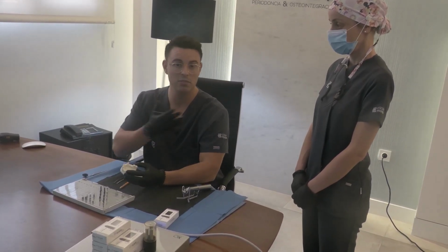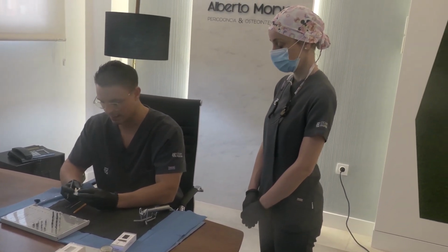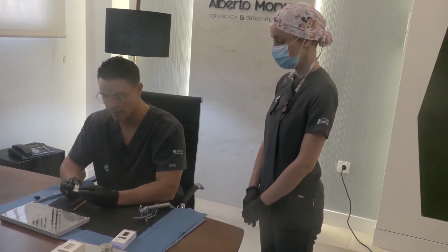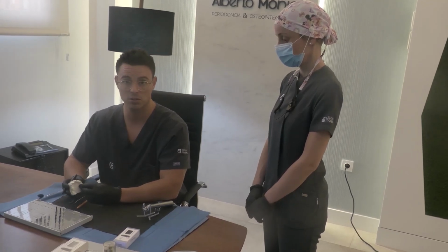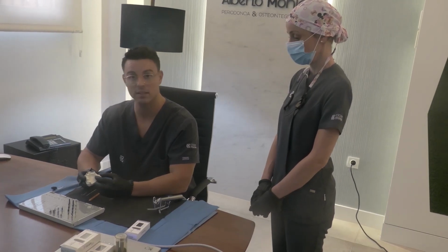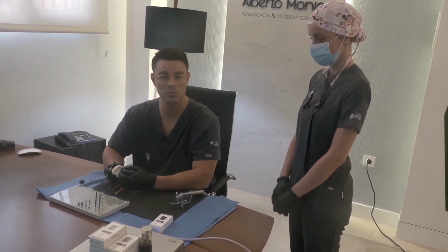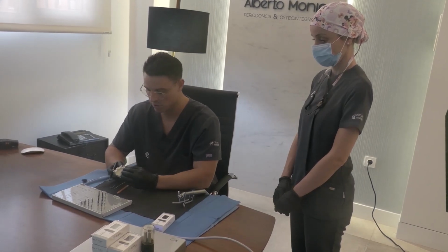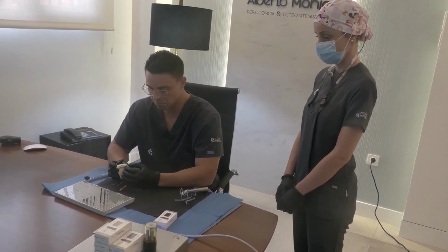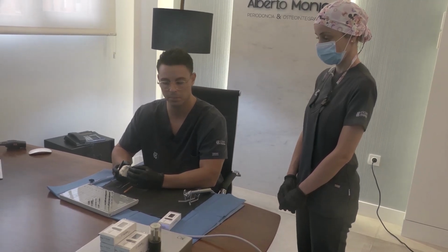So for that we have Mrs. Monje, who's going to be assisting us, and we'll be doing that in different scenarios. We're going to be placing a Ticare Inhex dental implant in a molar position and then in the anterior aesthetic area. So hopefully you can capture all the principles in order to succeed in implant therapy.